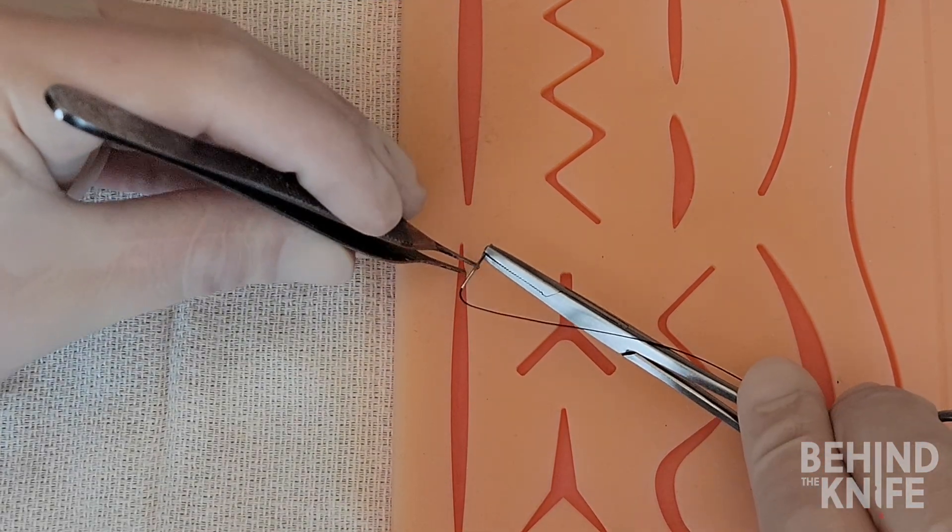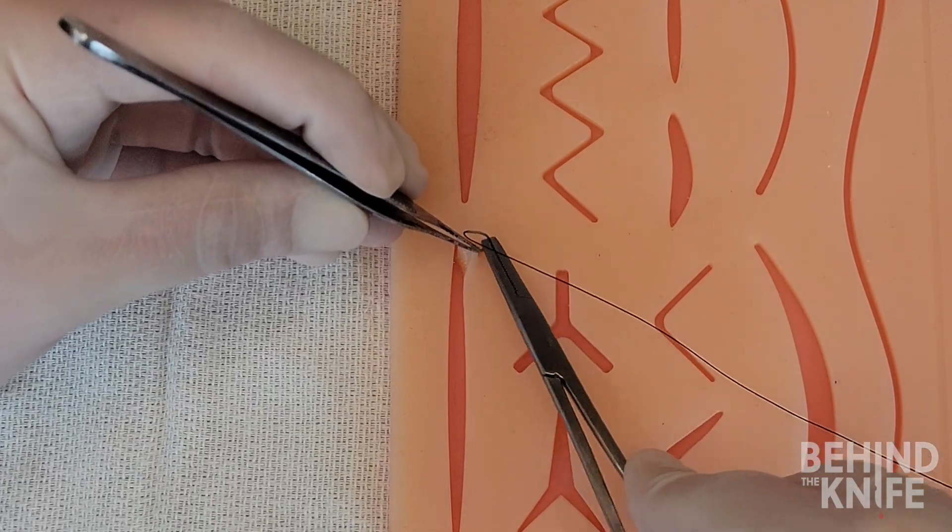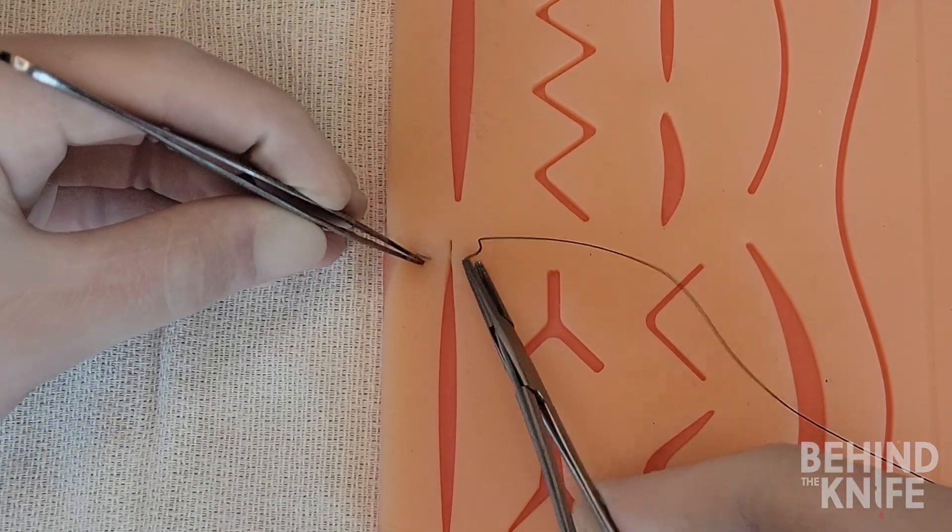The suture is a variation of the horizontal mattress suture and we will start the same way by placing a simple suture across the wound.